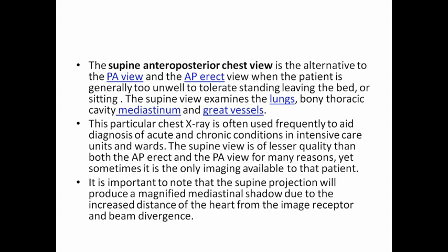It is taken just to make out the changes in the lung, if it is an ICU patient, to see pneumonia, any bronchial disease, any changes post-operative, or any fracture in the rib or scapula. That's what I told, trauma patient, if any trauma is there.